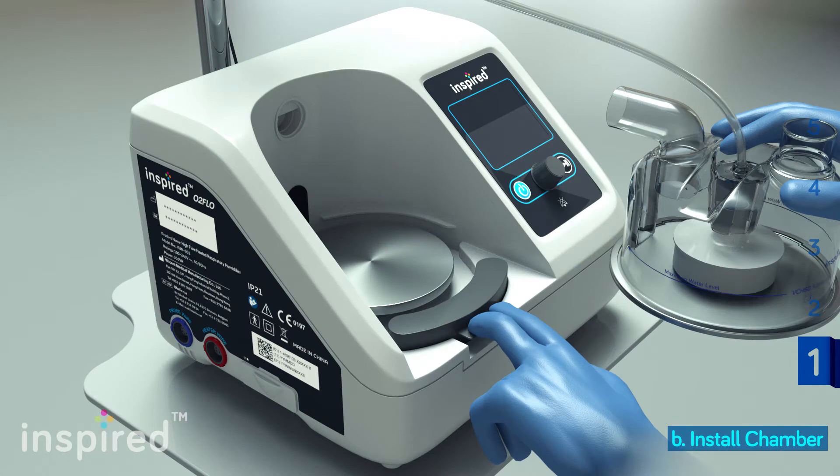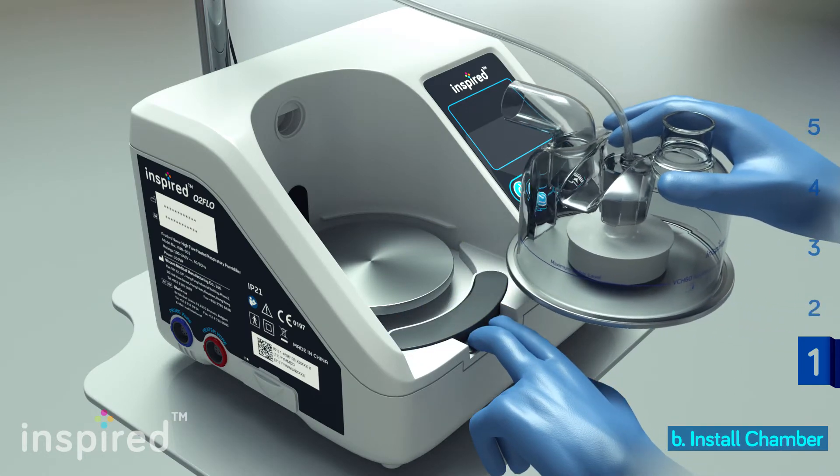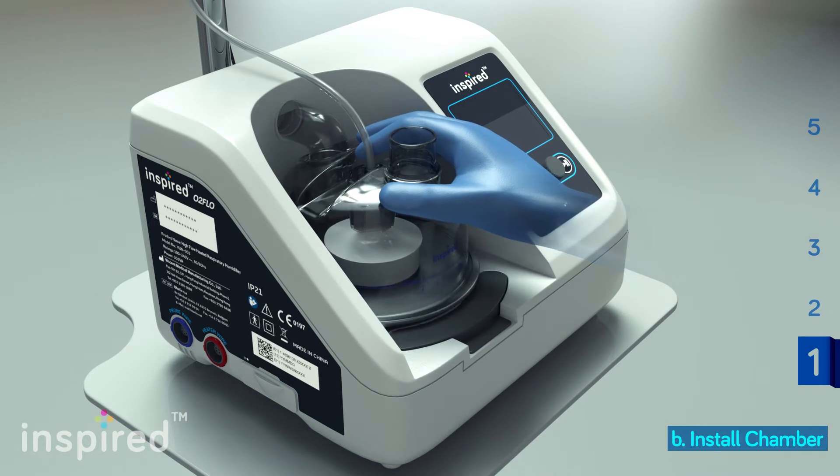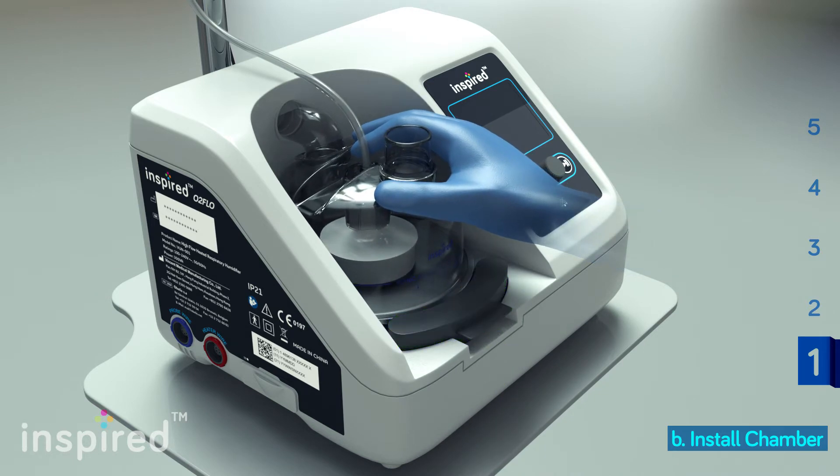Press and hold the chamber lock. Place the chamber on the heater plate with the air inlet facing forward. Slide the chamber forward. The latch will close when the chamber is fully inserted.